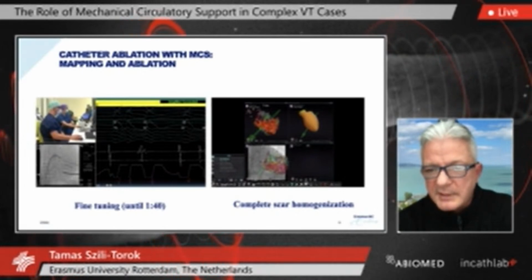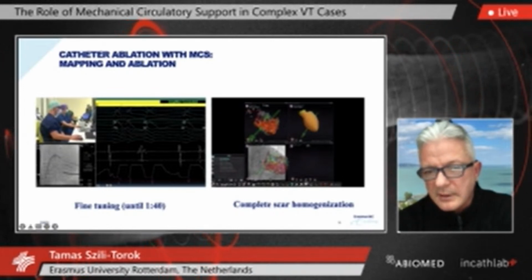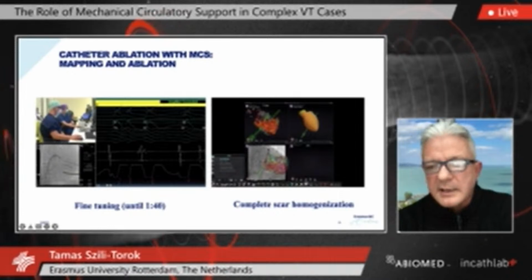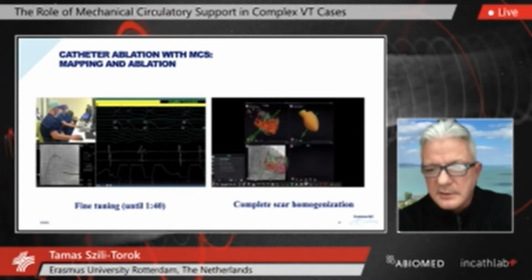But we tried to terminate all of the VTs during ablation. And at the end of the day, when we cannot induce the VTs anymore, then we go for a full scar homogenization.